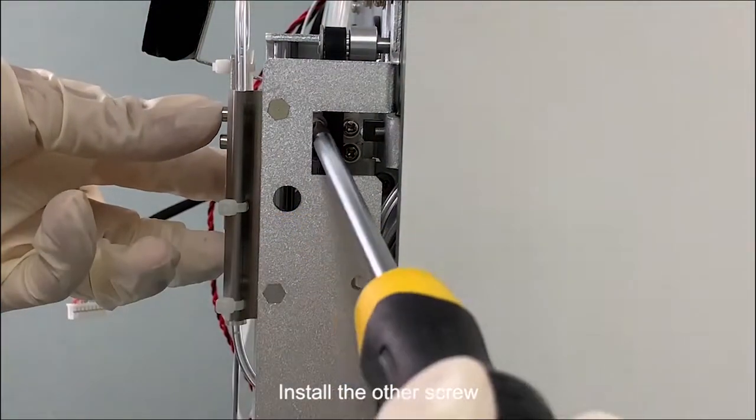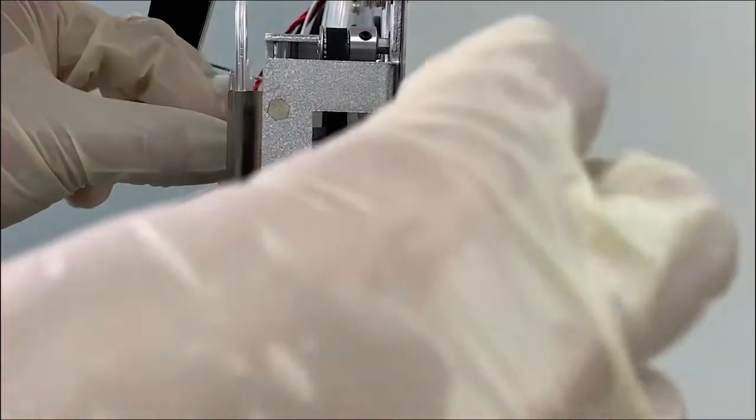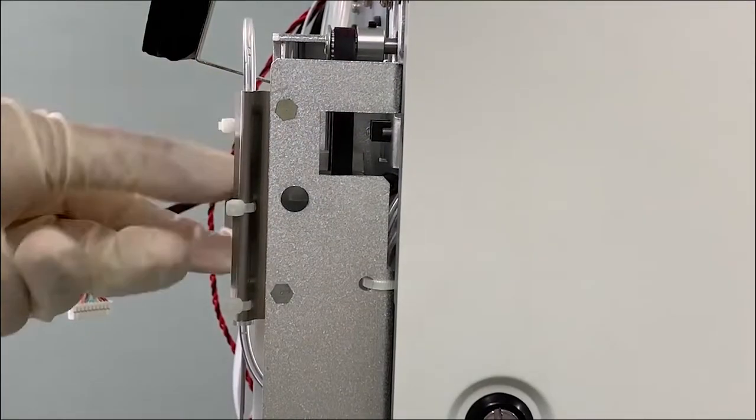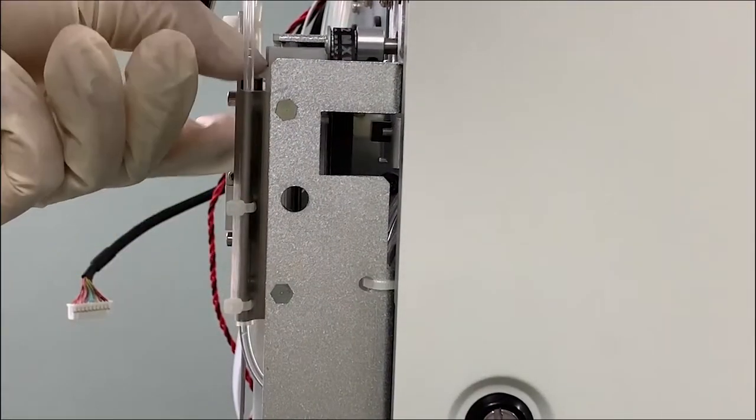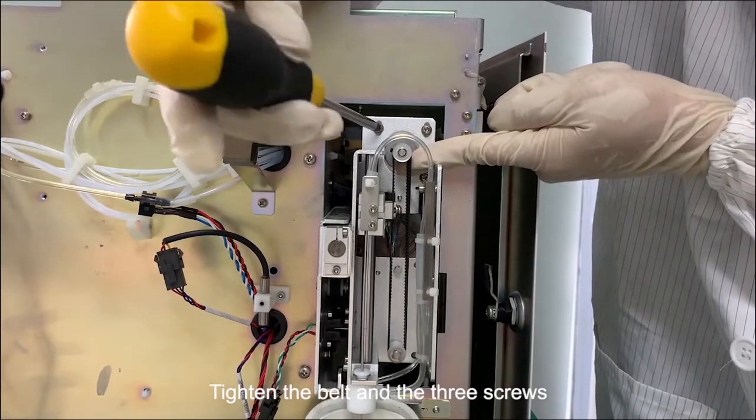Install the other screw. Tighten the belt and the 3 screws.